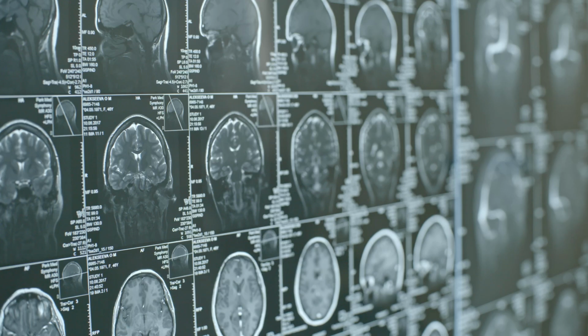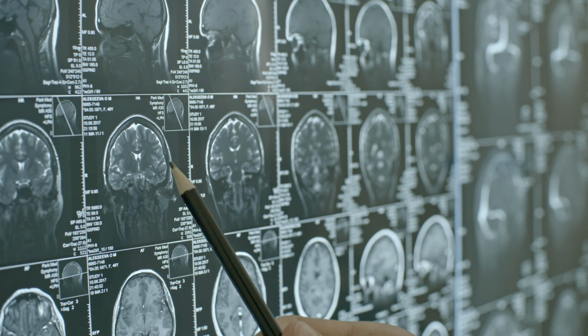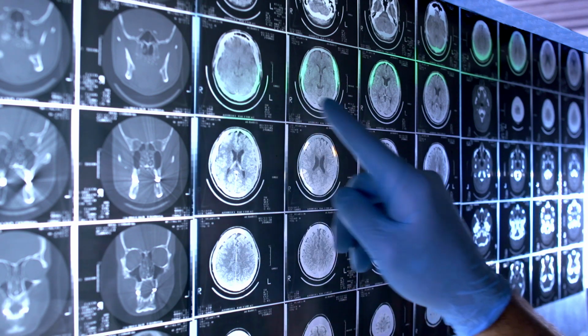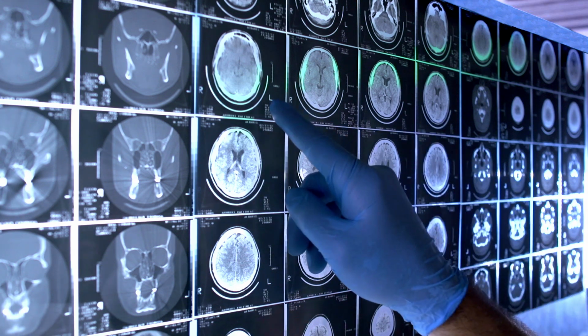If the CT scan of the brain is normal, then the neurologist may order something that's called a perfusion CT scan. A perfusion scan looks at the blood supply in the brain, and if there is a region of the brain that is not being supplied as it should, that can be the cause of the stroke. An MRI shows up smaller regions of the brain that don't get enough blood, or other reasons why there may be a stroke.